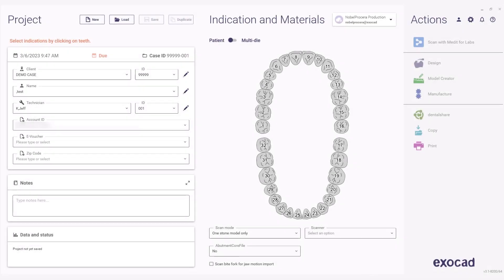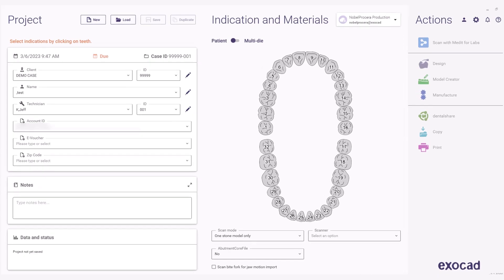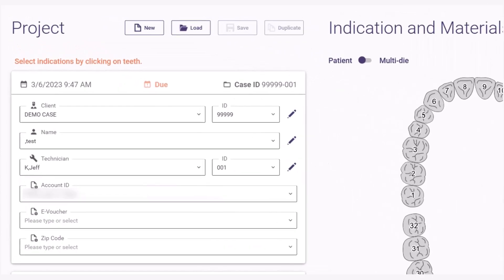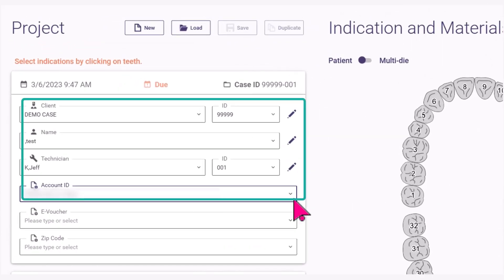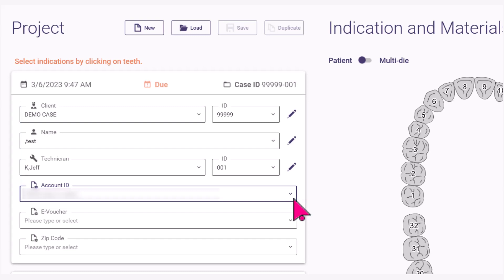Setting up a case for a Noble Procera Fulcontra Zirconia FCZ Implant Crown. First, select the client name, technician, and account ID, being sure to select the Noble BioCare account number under the account ID.